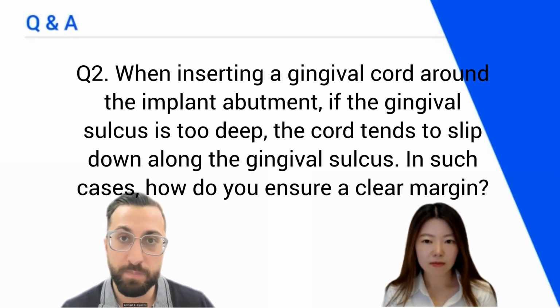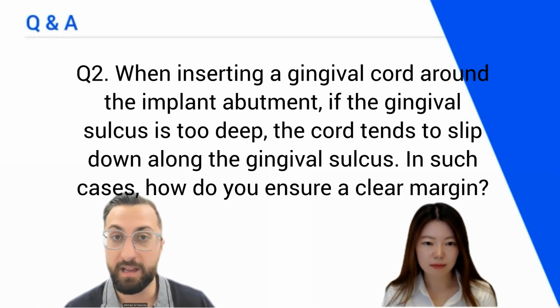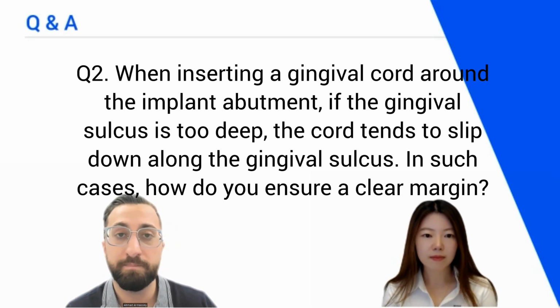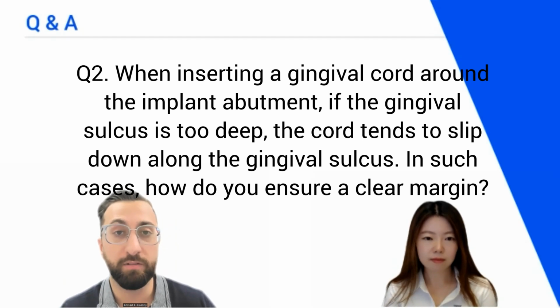I think a much better workflow is to use a scan body. Simply take the abutment off, put a scan body in, and then scan that. You don't need any retraction cords. You don't need anything. To just play devil's advocate, if you really, really need to scan this abutment, you don't really have any other option. Use your standard retraction techniques, laser, retraction cord, etc. But again, around implants, I would be very, very careful.